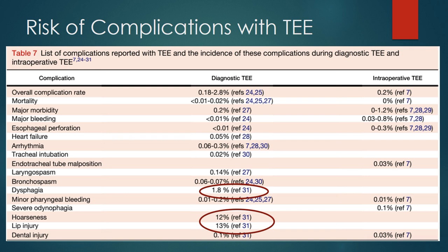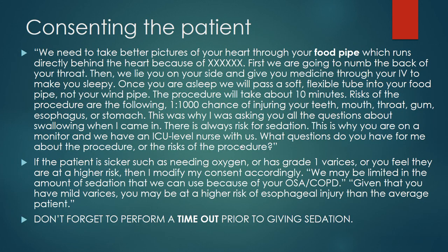These are more common. And you need to be careful with your bite block so it's not pinching the lip during the case, and oftentimes patients do just fine for this procedure. Please see my next talk on consenting the patient.